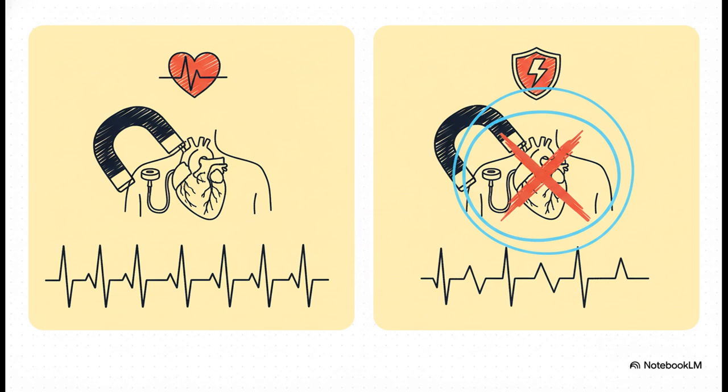Let me say that again. It does not change the pacing mode. So if your patient is pacemaker dependent and has an ICD, a magnet will not save them if EMI inhibits their pacing. You need reprogramming for that. This difference is absolutely critical.